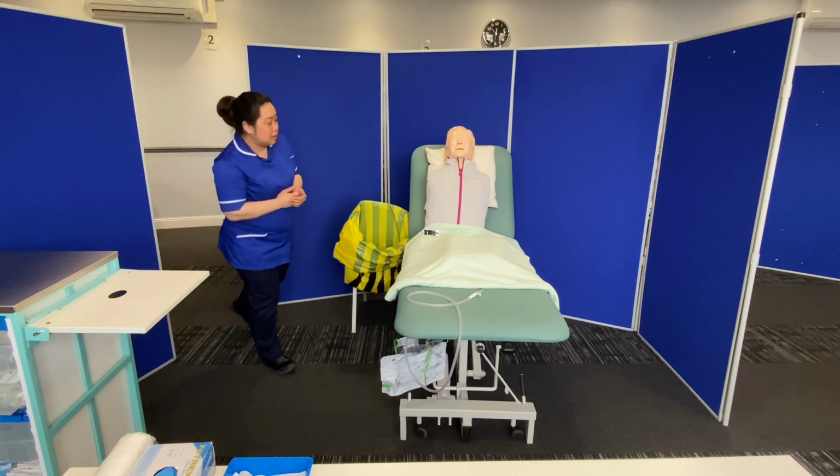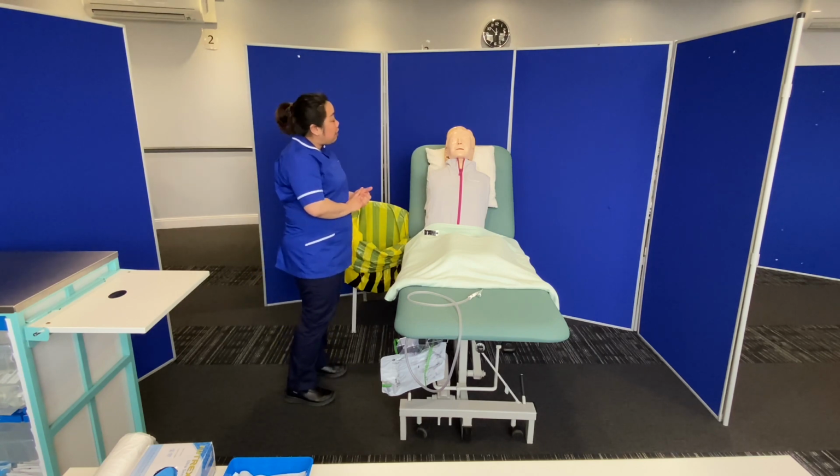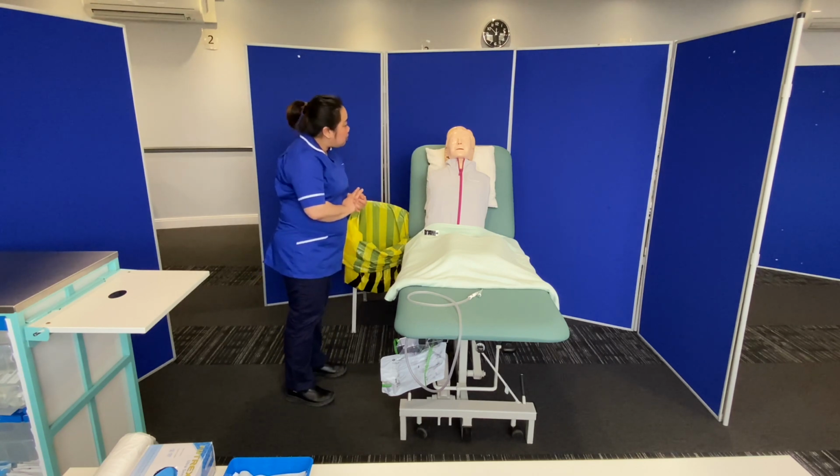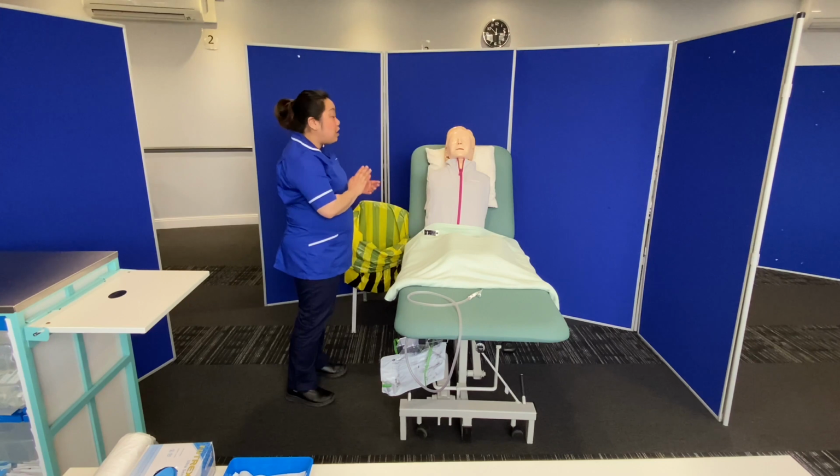Good morning. Good morning. Hello, my name is Aya. I'm one of the nurses that you have for this morning. The doctors have advised for us to collect a CSU or a catheter sample of your urine if you agree to doing that. Yes, it's okay.